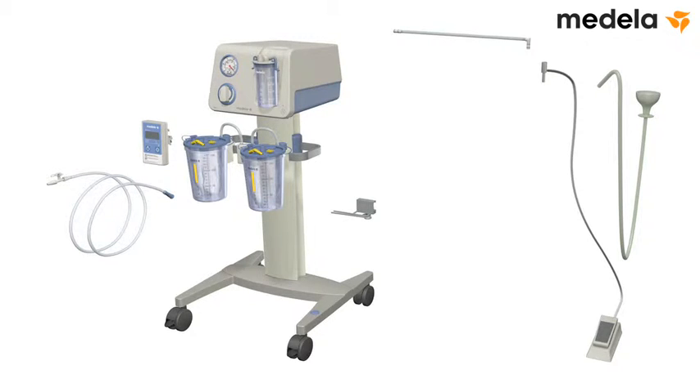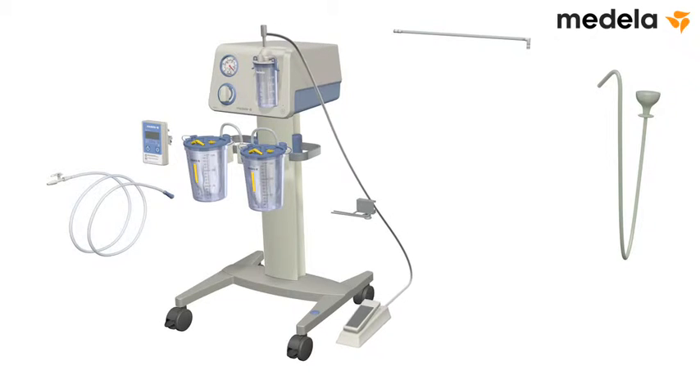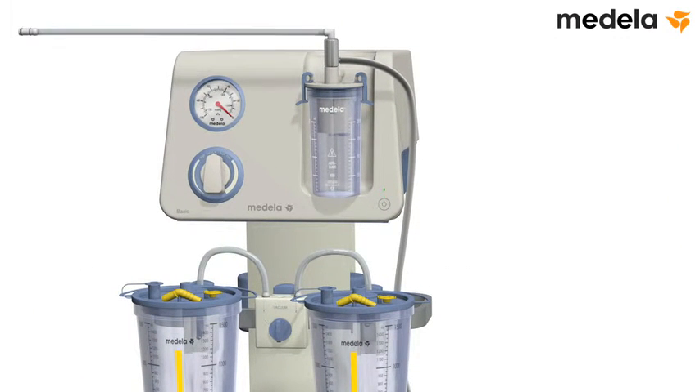Connect the foot vacuum regulator. Important: the silver three-way adapter must be fully seated into the overflow jar of the suction pump. Plug the supplied tubing into the three-way adapter, then plug the other end of the tubing into the vacuum port of the changeover valve.